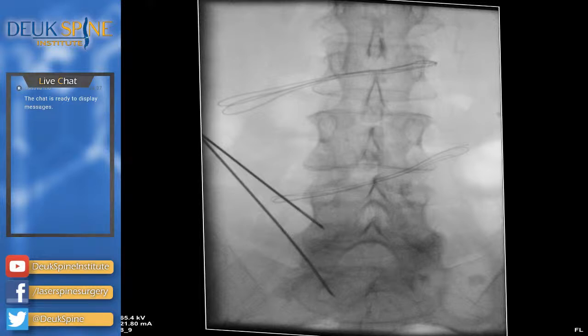And those lines, if you're wondering what they are, they're just the Raytec. You guys see those lines on the x-ray? That's this thing right here. It's a thread in the Raytec. So you never leave a sponge in a patient. You can always see them.